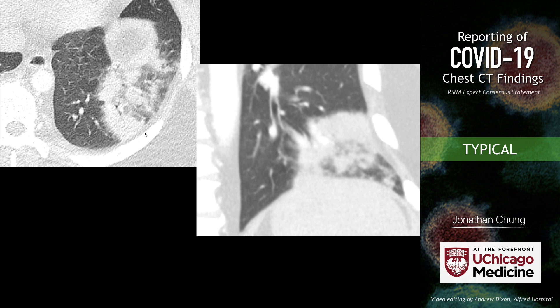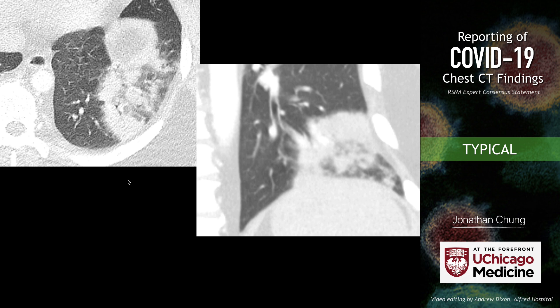Here's a patient with left lower lobe consolidation and ground glass opacity. What I'm trying to outline here is the fact that this actually has a reverse halo configuration — almost a targetoid appearance. We have this peripheral consolidation surrounding central ground glass opacity, forming a rim of consolidation. Overall, this would be consistent with the reverse halo sign, also known as the atoll sign, which is suggestive of organized pneumonia. Based on the literature, these patients seem to develop this pattern at least on imaging. The rim doesn't have to be circumferential, but you need a significant amount of peripheral rim consolidation with central ground glass opacity to call it reverse halo.